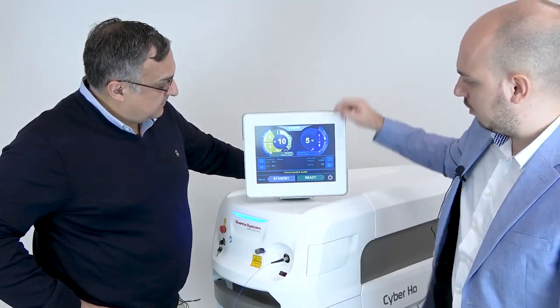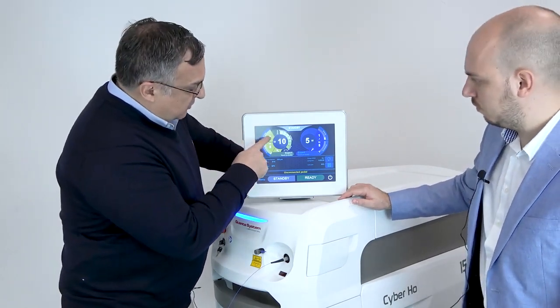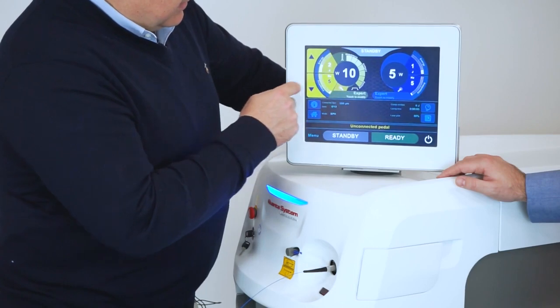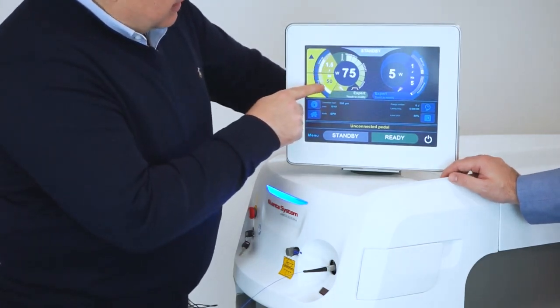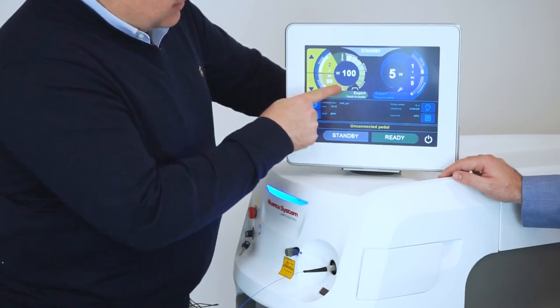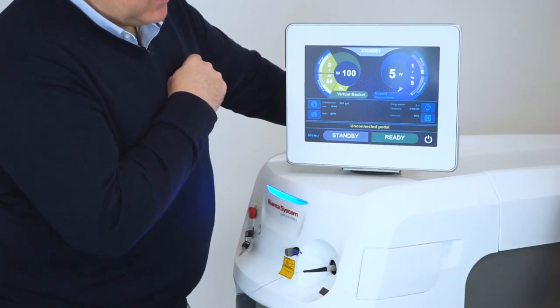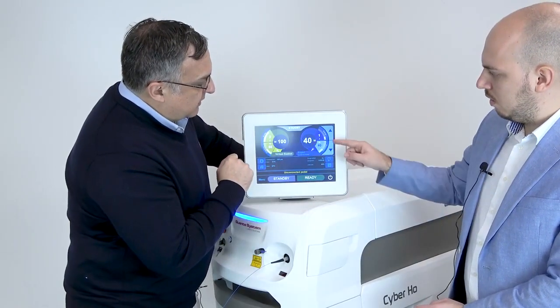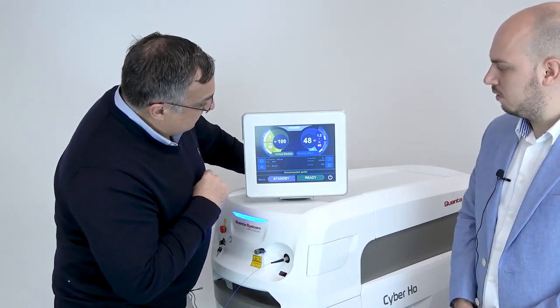The system recognizes my favorite fiber for HOLEP. To input settings: I choose 2 joules and 50 hertz as my preferred settings. Then pressing the magic wand and choosing virtual basket — my favorite setting — completes the left pedal configuration. For coagulation on the right pedal, I choose around 30–40 hertz and 1 joule, then select the bubble blast setting, which produces a very soft and nice spread of energy for coagulation. And we're all set.